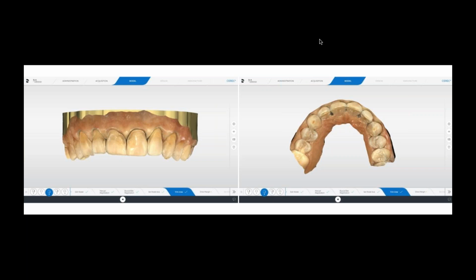What is very important is to prep the elbow of the veneer, and it's exactly this area here where the proximal surface meets the cervical part of the margin. Make sure that we pack the 000 cord and prep that elbow of the prep as palatal as possible, so we provide, in this case, Telmo, a nice possibility of having an emergence profile and being able to close any of those black triangles. If we stay too facially in those situations, maybe there is no room for the ceramist to close that, and we can finish with a black triangle.